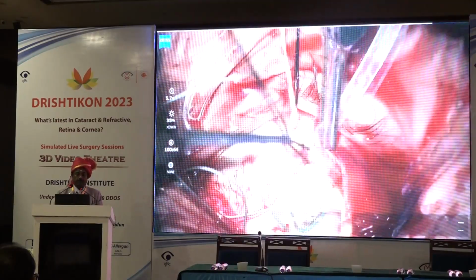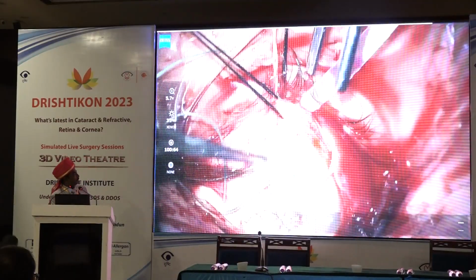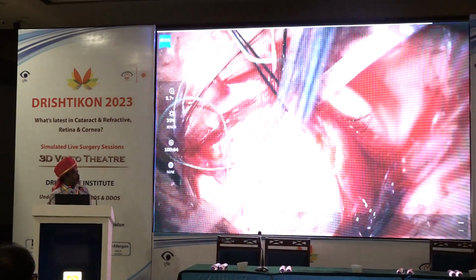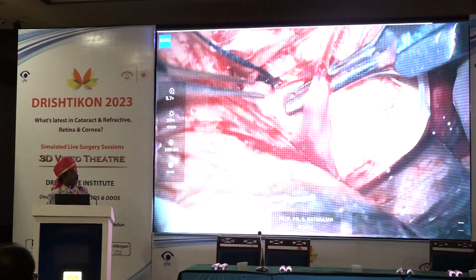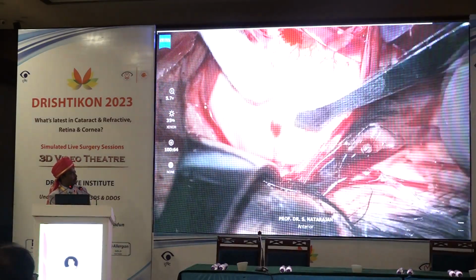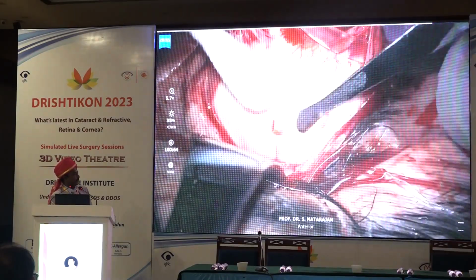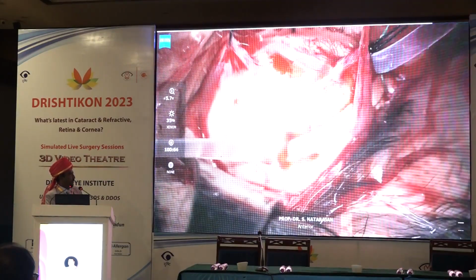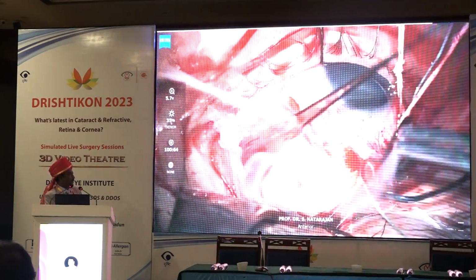And here you use only one suture, and you make sure that the knot is on the center of the buckle, so that now I'm passing the 240 band behind the muscle and the sutures, and then make the scleral flap, which I make so that it's like a belt loop. So that's why it's called a belt buckle, or a scleral buckle for 360 degrees.